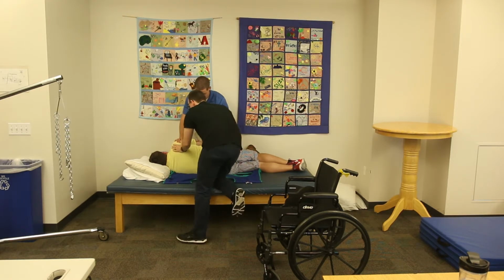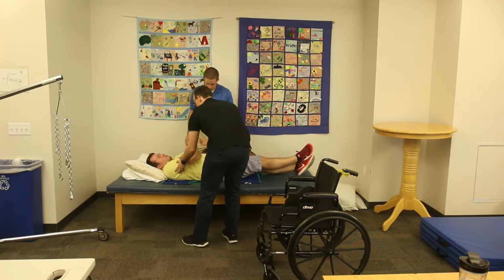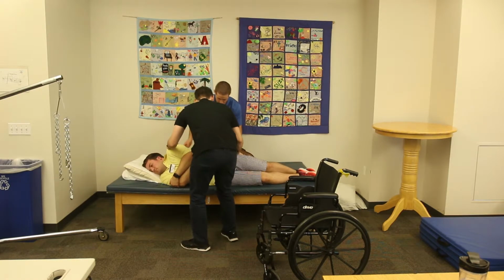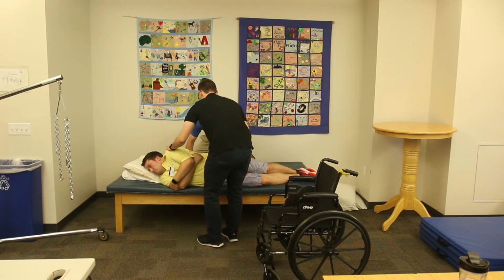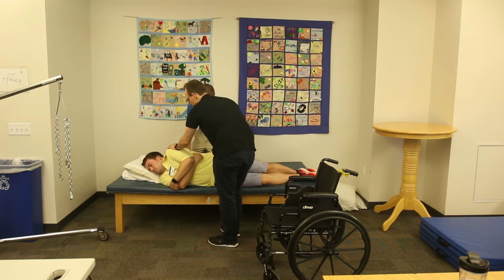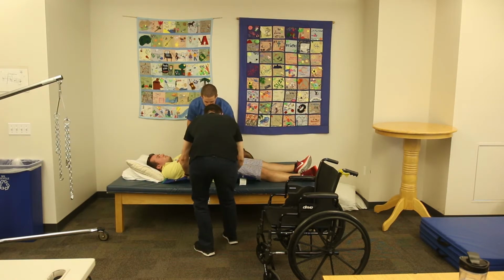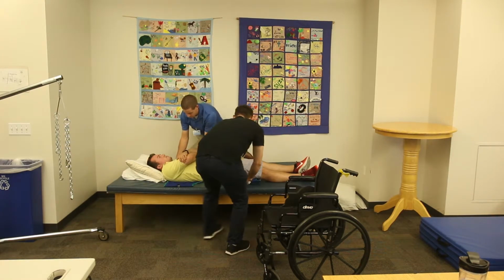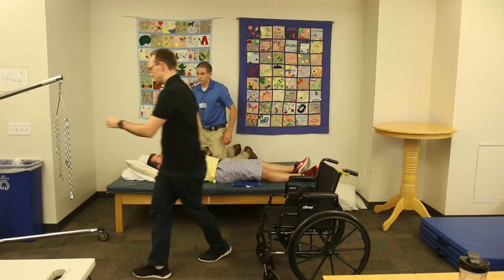All right, let's roll back. 1, 2, 3. Roll it back, so I see. All right, then we're gonna roll towards me, and same thing. Ready? 1, 2, 3. How's that look, Dylan? Looks good. Okay, we'll roll back. 1, 2, 3. Gotta make sure that position is good. Gotta make sure it's secure. I think this looks good. All right, I'm gonna grab the Hoyer over here.